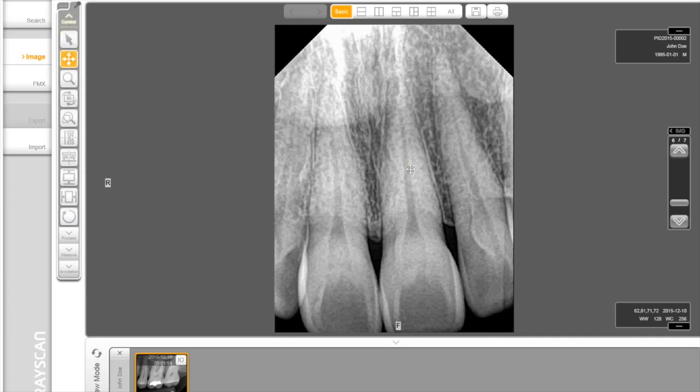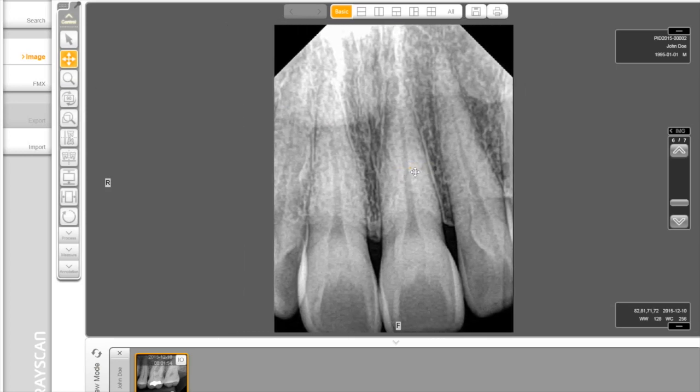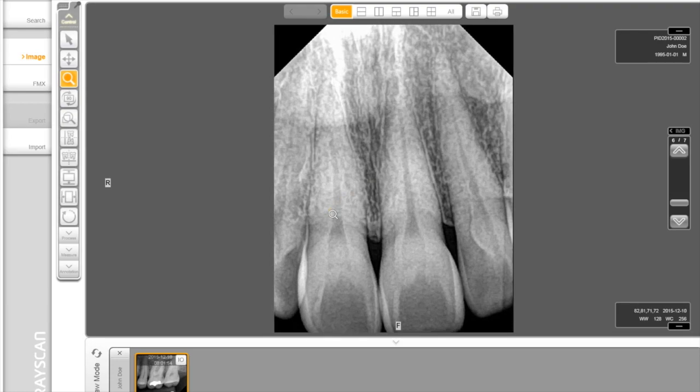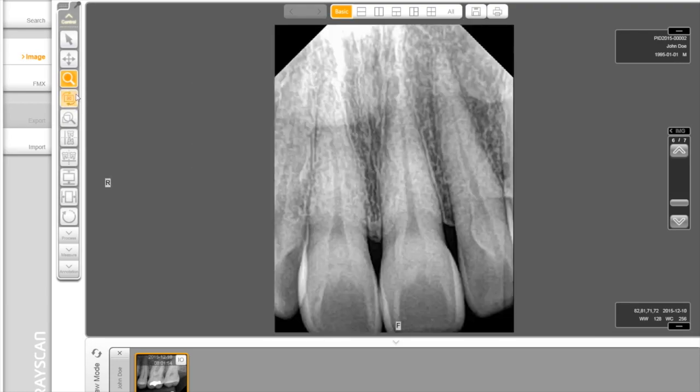If you single left-click on Move, this allows you to move the image. You can also go to Zoom. This tool allows the user to click and drag on the image to zoom in and out. Below is the Rotate tool. The spot magnifier button will zoom into a user-specified area of the image by clicking and holding the left mouse button.